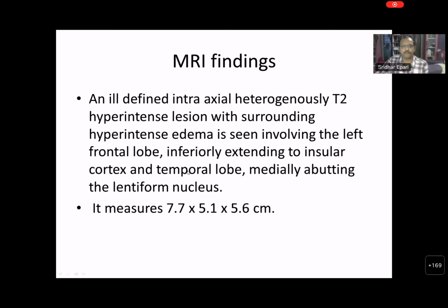Okay. So to add more, when something shows heterogeneous features, it also tells you that the histological features are probably heterogeneous too. The lesion has heterogeneous features. Hyperintensity can be due to proteinaceous fluid. With this, we have a young lady with a cerebral fronto-insular space-occupying lesion, a diffuse lesion. Anybody from the team, what is your thought process here?